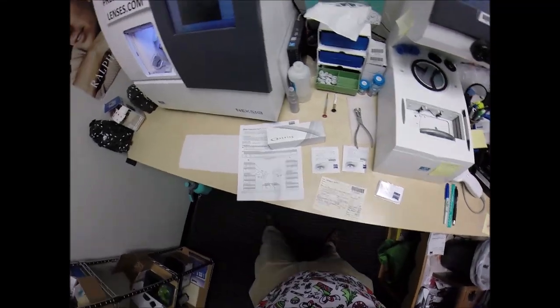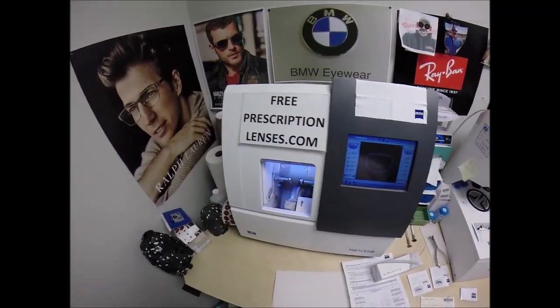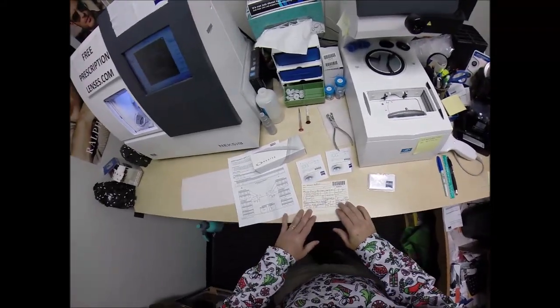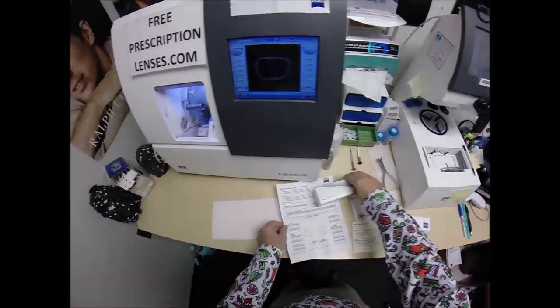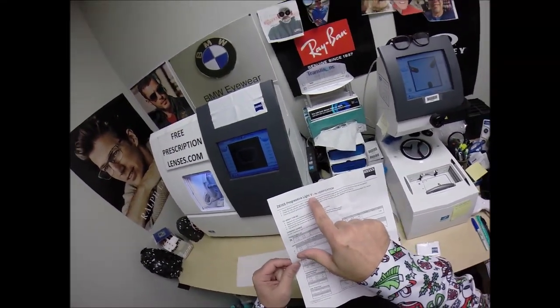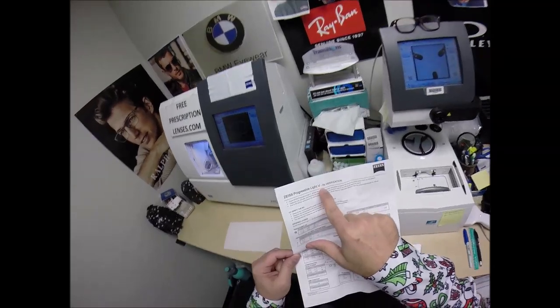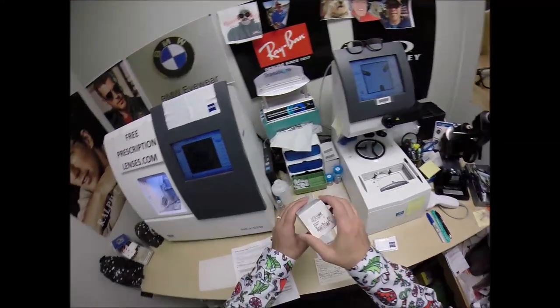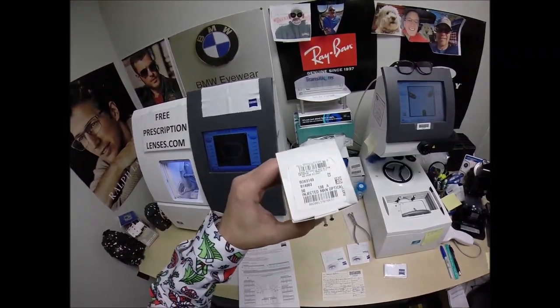Hello everyone, Seymour Better here with FreePrescriptionLenses.com, and tonight I get to do something for me. I'm cutting my new lenses. This is a new Progressive from Zeiss — it is the Light V. I've been told it's comparable to the Varilux X, hence the term V. And I'm going to put them into my Oakley 8149 Pitchman.